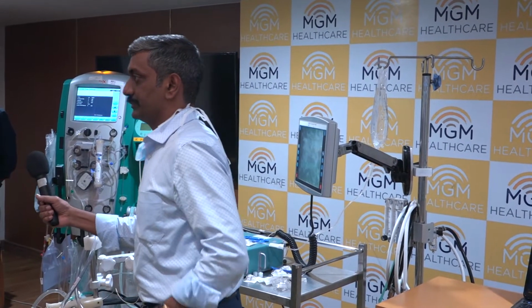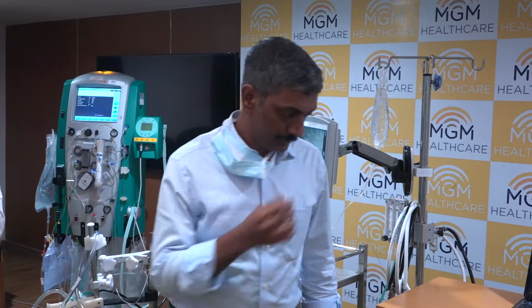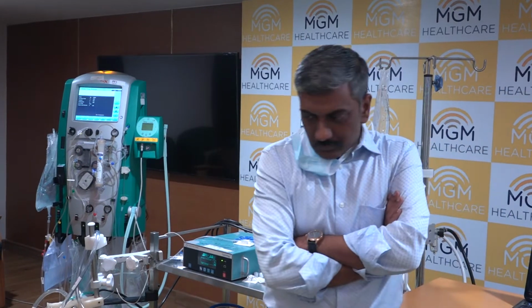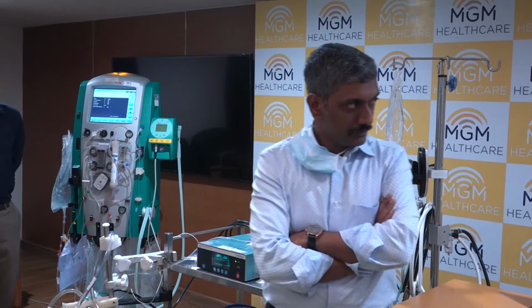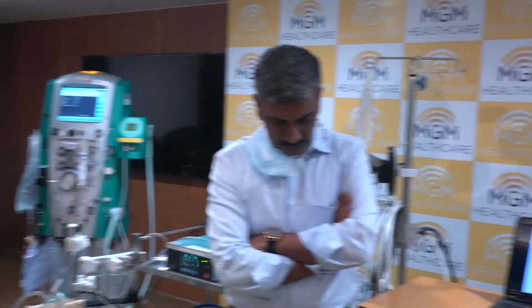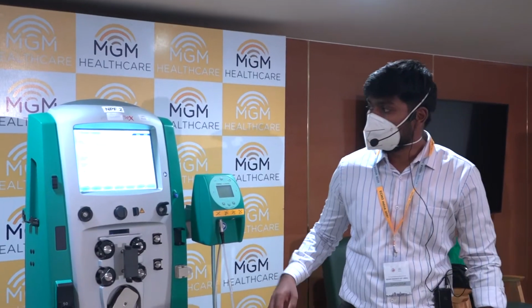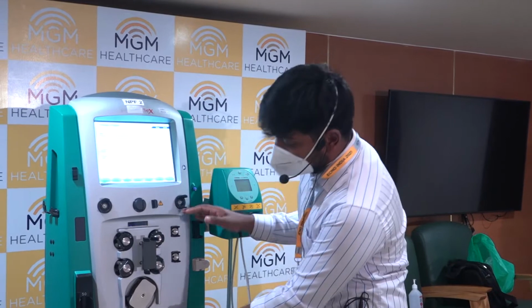So what we'll do is we'll just have a quick view of how the CRRT machine is getting connected. From there, we will be demonstrating how the CRRT machine is connected with the circuit. Over to Adam. Good afternoon, everyone. I'll just quickly demonstrate how to connect a CRRT circuit to the device. I'll explain the device first. The first is the monitor. The second is the pumps and sensors in there.